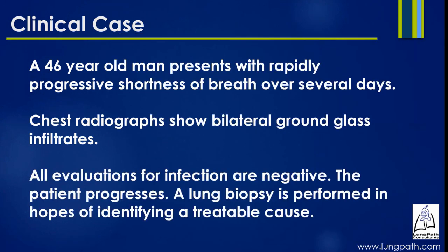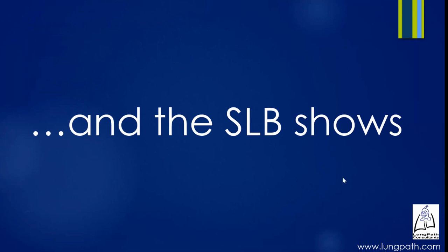All evaluations for infection, clinically and by laboratory, are negative. The patient's condition progresses to the point where, about 10 days after presentation, a lung biopsy is performed in hopes of identifying a treatable cause. And this is the biopsy that arrives on your desk.